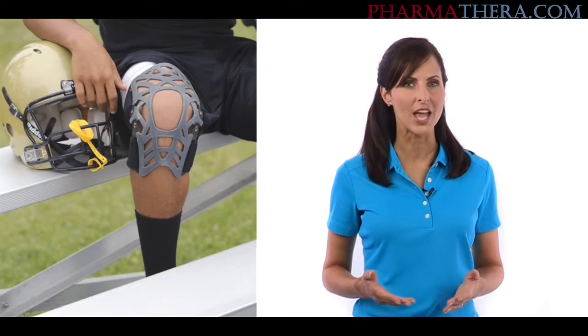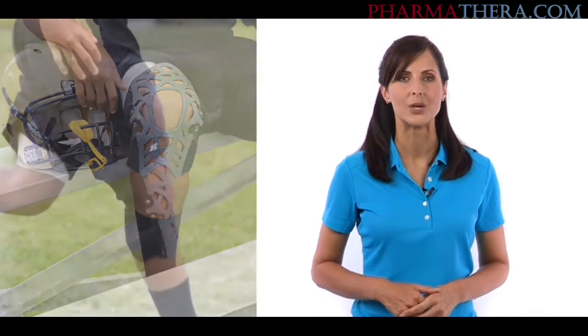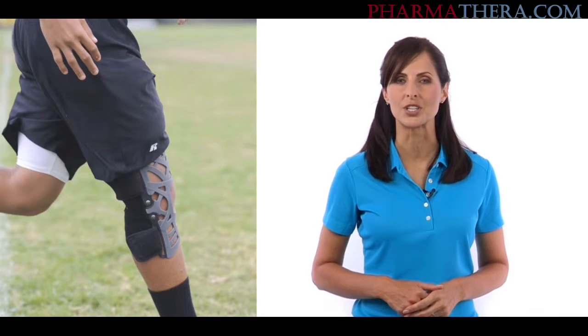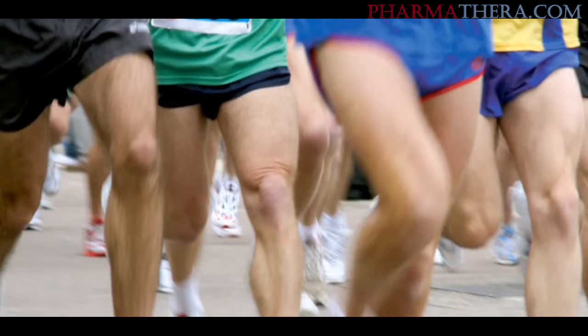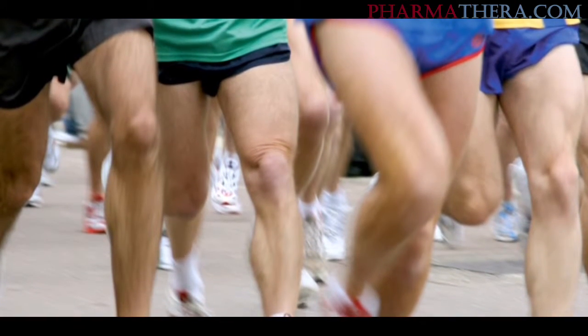If you're suffering from knee pain, the Reaction Knee Brace can help. It was developed by an orthopedic surgeon to provide pain relief and stability for runner's knee, jumper's knee, and other conditions that can cause pain to the front of the knee.